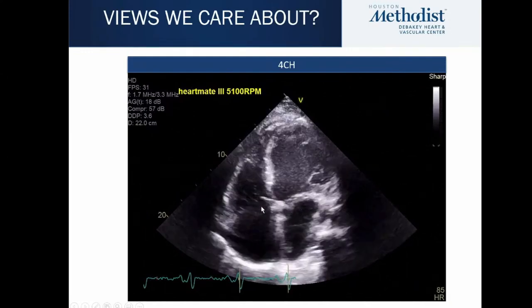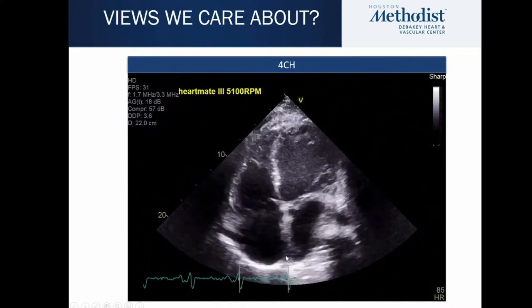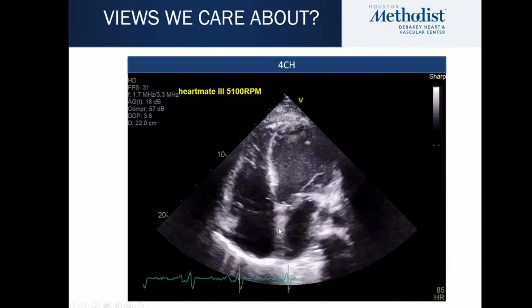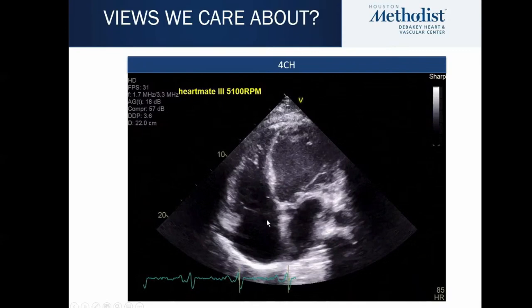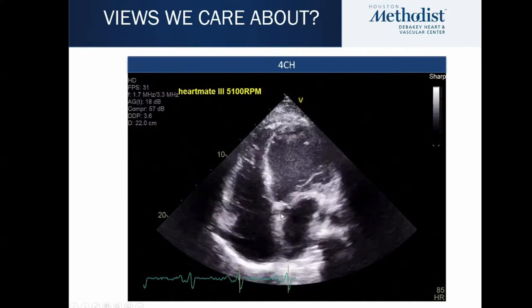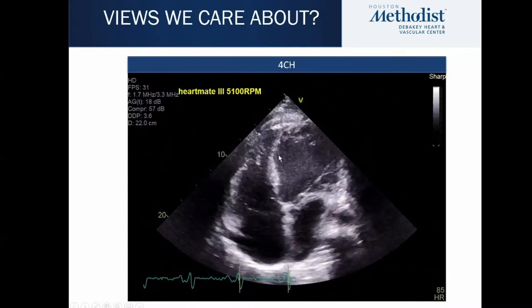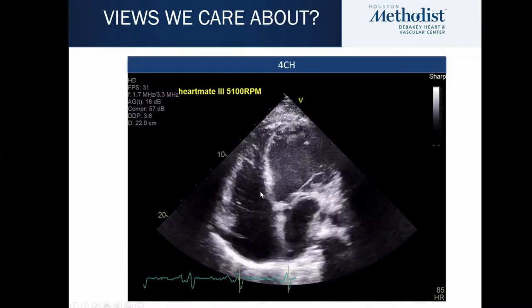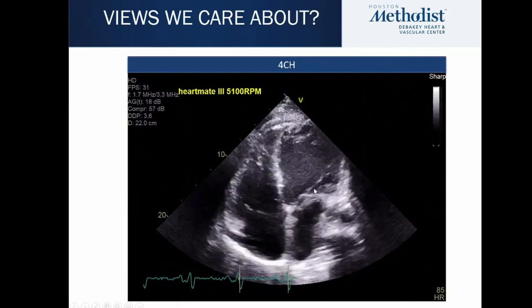The size of the LA and RA are important, and the relative interatrial septum location is also important to guesstimate whether the patient has RV failure or not. If there's a high RA pressure, the interatrial septum might be pointing towards the left atrium. Similarly, if the right ventricle is humongous and there is RV failure, you would see the interventricular septum deviating towards the left side.